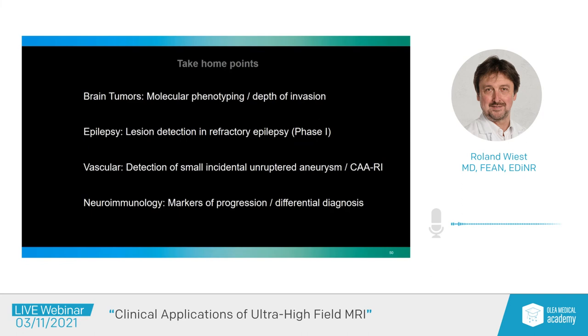Then I think one of the already, in part, established methods is the additional diagnostic yield of detecting a new or a potential epileptogenic lesion. If you are able to inform the neurosurgeon ahead of the implantation, during the pre-surgical workup but also during the operation, which area is the one at risk and where he should resect the lesions, so as not to touch the right brain area, it would bring a strong additional advantage to the epilepsy surgery programs, and we have it integrated into our program already.